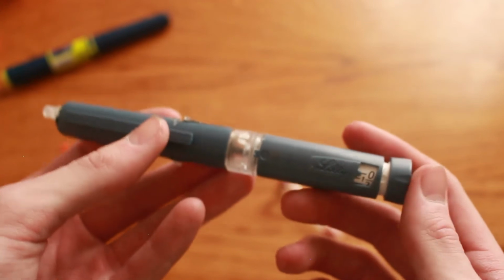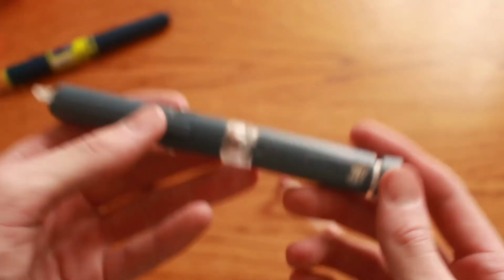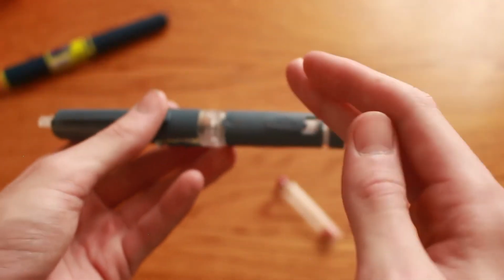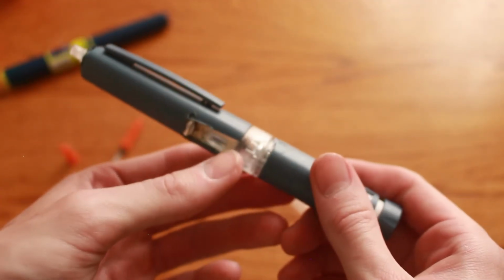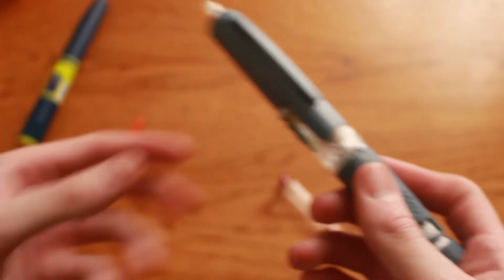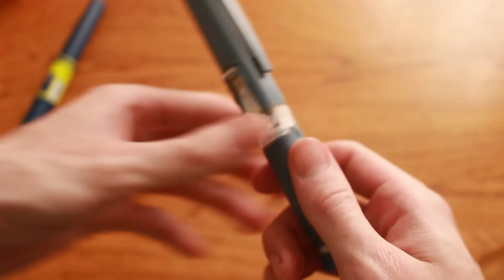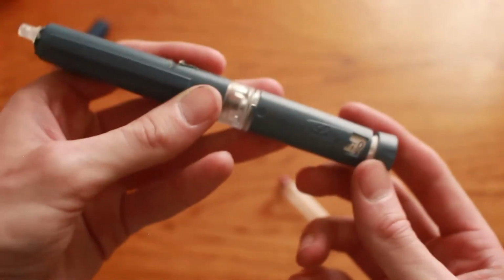Now, my main issue with this is that, unfortunately, the insurance I currently have, and I am switching to a new one soon, doesn't pay for Humalog pens. And I specifically need the Lilly brand Kwikpens. I'm not sure if it has to be Humalog, but it does have to be the Lilly brand Kwikpens to do this, because no other pen seems to work with this idea. The Tresiba pens, for example, from Novo, their plungers don't go back. This one does. I can literally dial this one back and reset at 0. With the other non-refillable pens, you can't do that. So it seems that only the Lilly Kwikpens work.